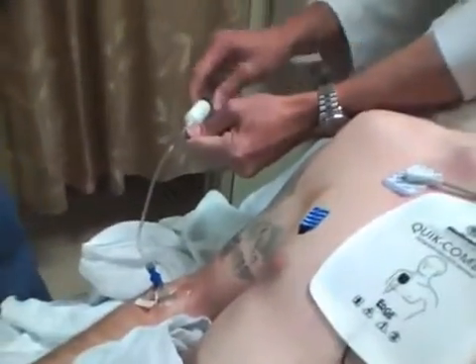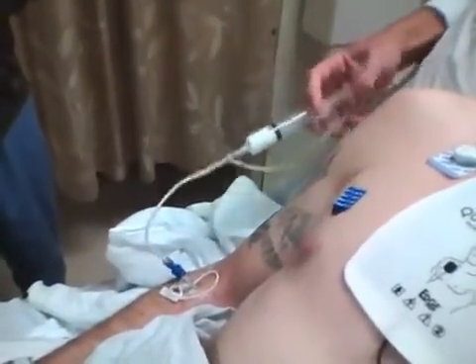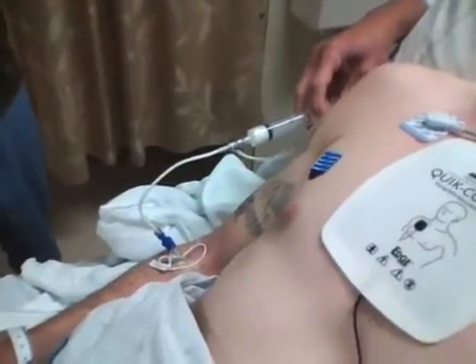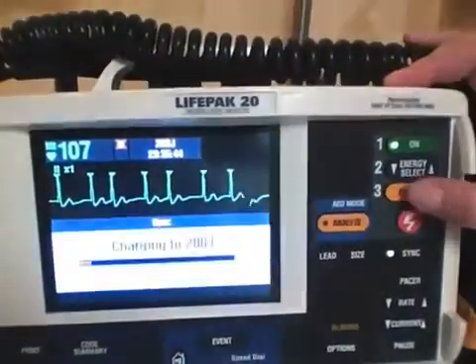The patient is sedated with any combination of procedural sedation agents. In many instances, propofol is selected, mainly because it is rapid acting, produces deep sedation, and some sense of amnesia for the events. Once the patient is sedated, the monitor is checked to make sure it is in the synchronized mode and sensing.